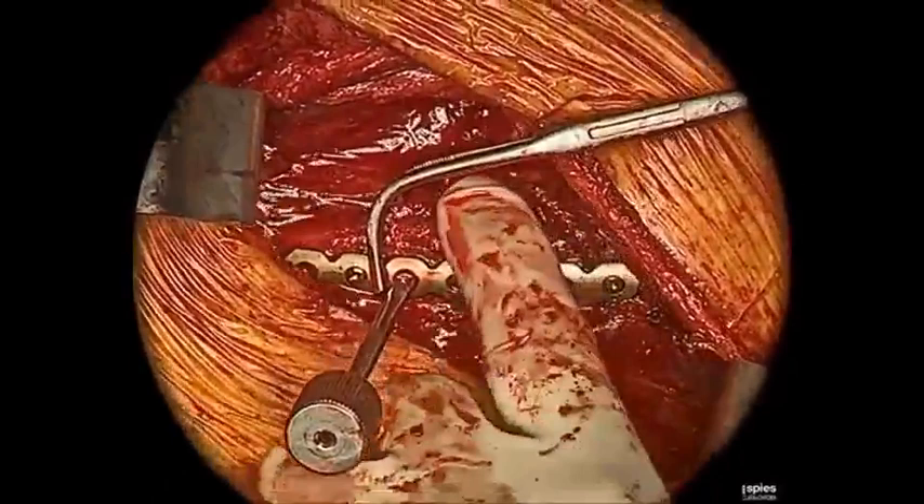All systems come with rescue screws, which are non-locking screws. If you're having trouble getting the plate flush with the rib, you can use a non-locking screw — keep turning it until the plate is flush — and then put two or three locking screws in to get your stable construct. At the end you can remove the non-locking one and replace it with a locking screw. Preferably you'd have all locking screws in the end, but you can use a non-locker as an adjunct to achieve apposition of the plate to the rib, which is critical.